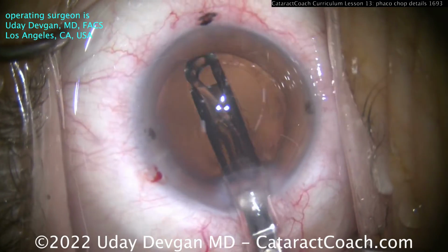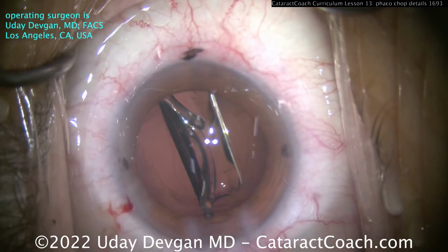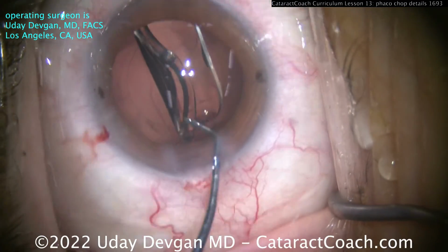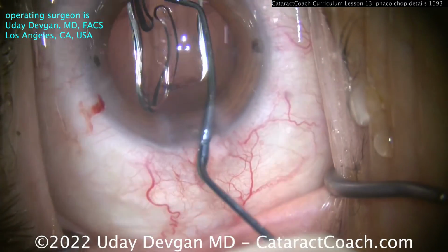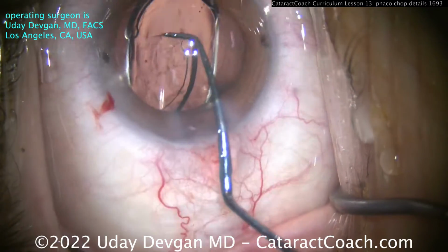It's going to be a single piece acrylic lens here. This is an EDOF lens, extended depth of focus. This would be an Alcon Vivity lens. And you can see it's also the toric version, so we'll get that lined up. See the toric marks at the haptic optic junction.